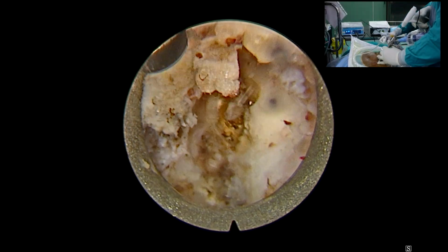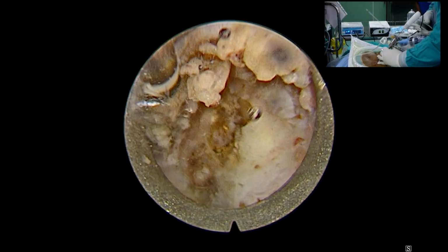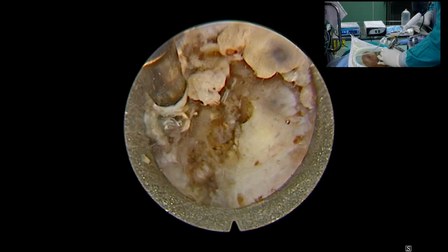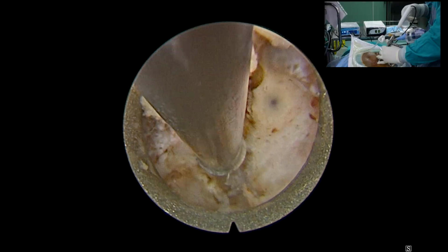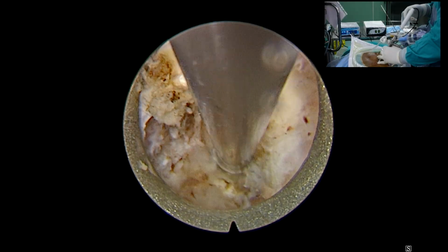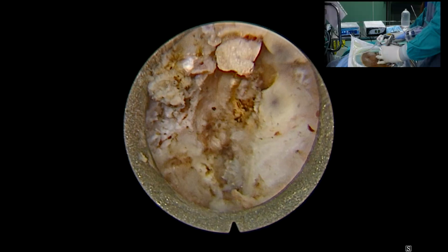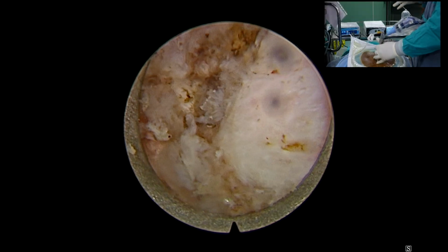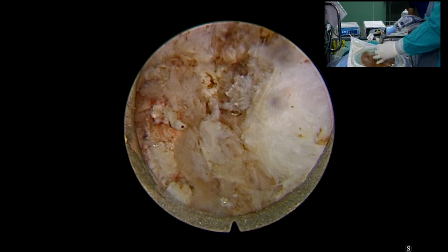So we are starting drilling now, and we'll clear tissues as and when required. Starting drilling from our upper lamina, IAP junction, spinous process, laminar area, and whatever we are looking at should be drilled first.